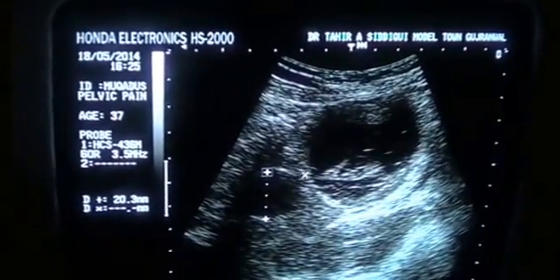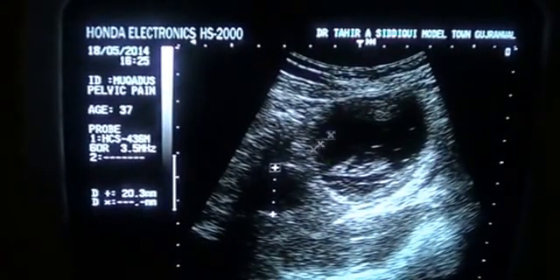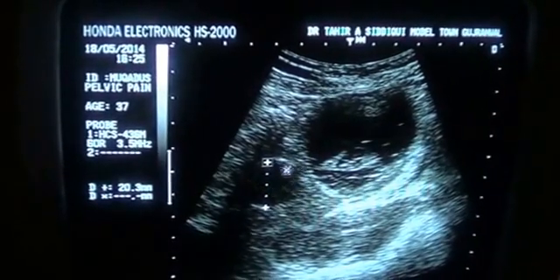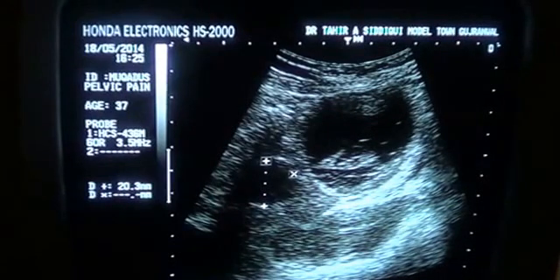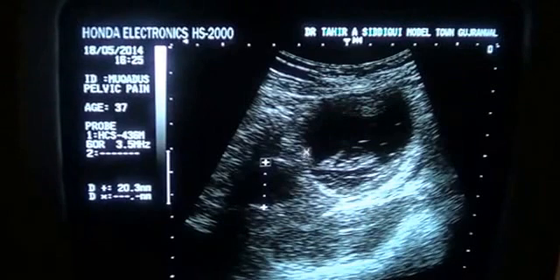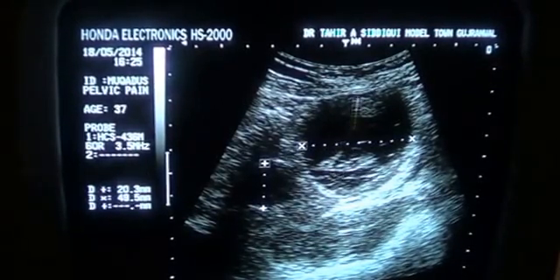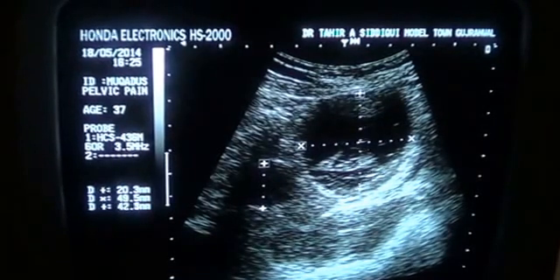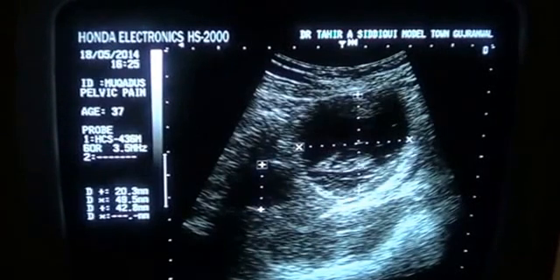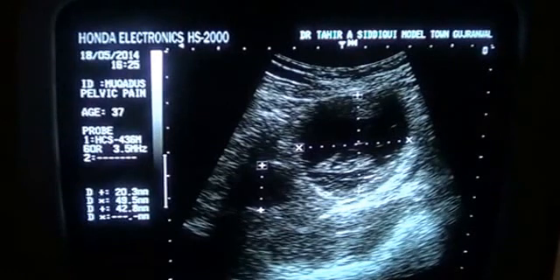Now this cyst communicates, I'll show you, with this cystic area. Now this is a cystic area in the fundal region of the uterus with the opening into this well demarcated thin wall cystic area with dependent region echoes. These are dependent region echoes, and you will see multiple septals in other view.